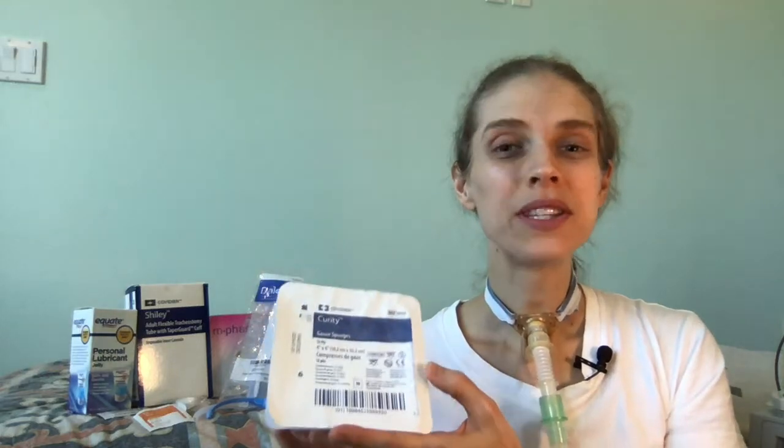The next item I highly recommend is gauze. I always clean off my tracheostomy tube area with some gauze. I get it wet with some soap and water and simply clean around my tracheostomy tube before I even start the procedure. And this helps reduce the amount of bacteria on my skin. I also have gauze handy when I'm doing the tracheostomy tube exchange, because once you pull out the tracheostomy tube, there will inevitably be some sputum or something that comes up with your tracheostomy tube. I always have this handy. I wipe off anything so I don't put that back into my trachea once I do the tracheostomy exchange.